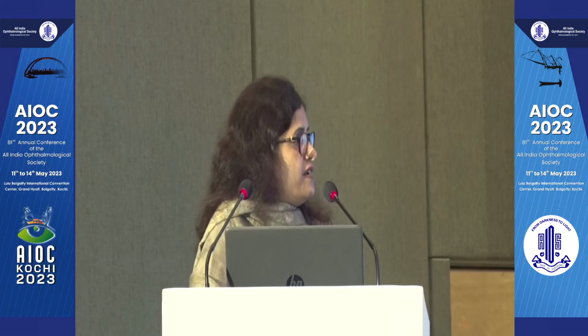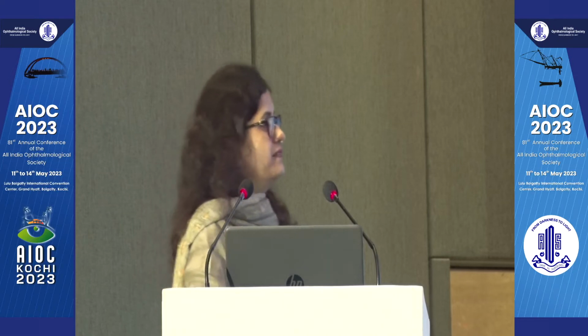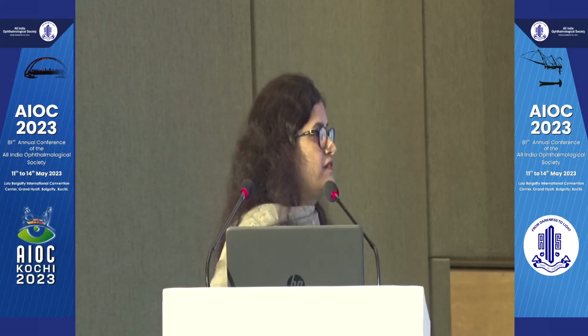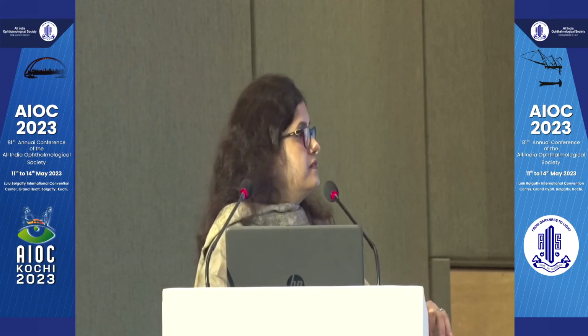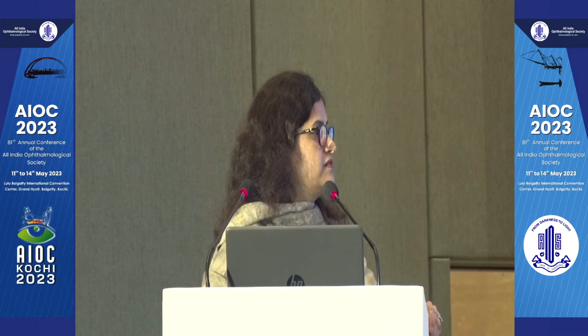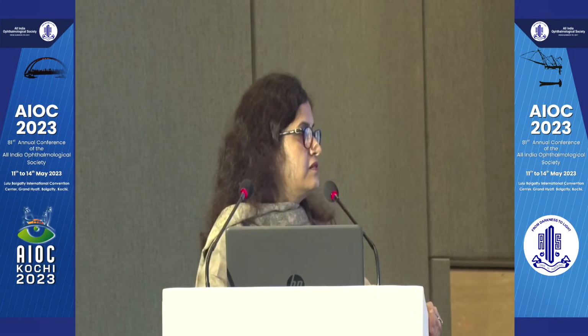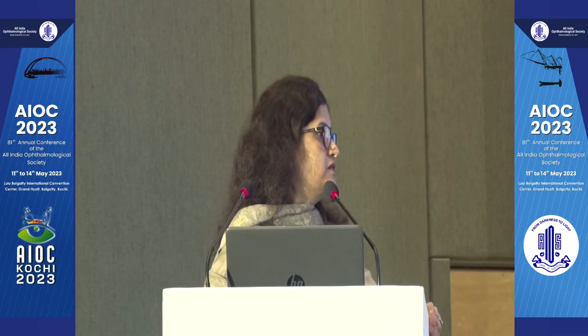But yes, hands-free gonioscopes are also available. I think you can ask Swati also what she uses. Dr. Swati, what do you use? I also use with the handle, because you need a very cohesive viscoelastic for the SX prism, the Eiffel Tower one, to stay on the cornea. If you use normal HPMC or Ocugel or a less cohesive viscoelastic, it just slides away. So you want the angle to be under your control. So I use it with the handle.